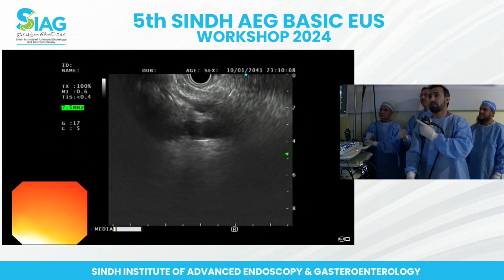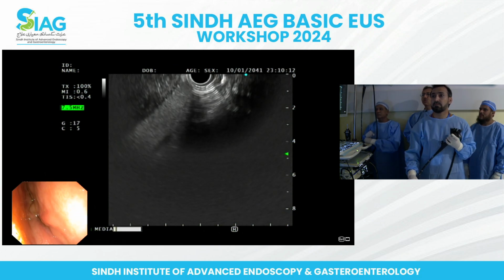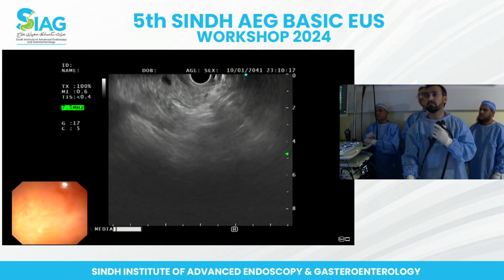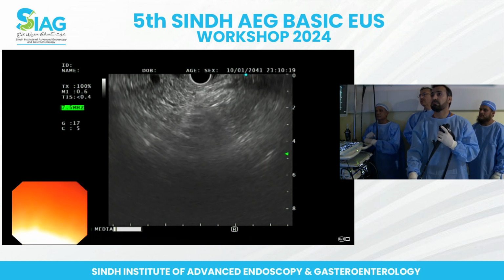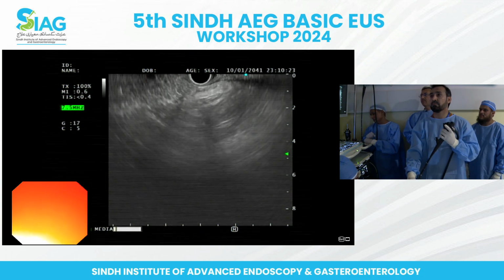Come back a little and go again, back out in the stomach and then go back in. You need to identify the portal vein. Portal vein with the confluence, yes, very good. Now try to identify the portal vein, right? Where's the portal vein?